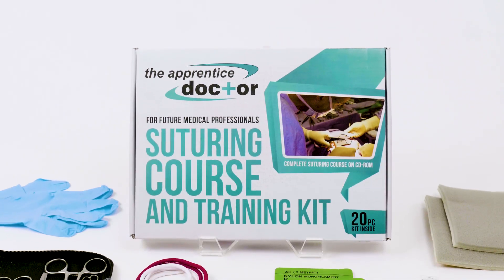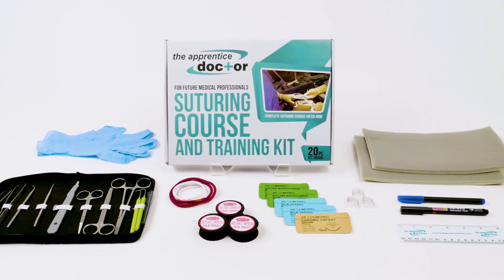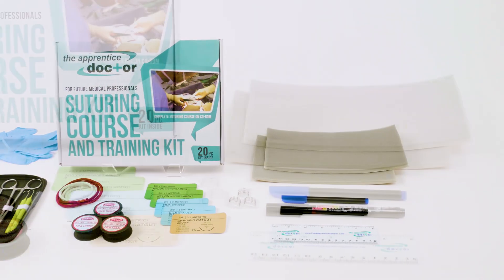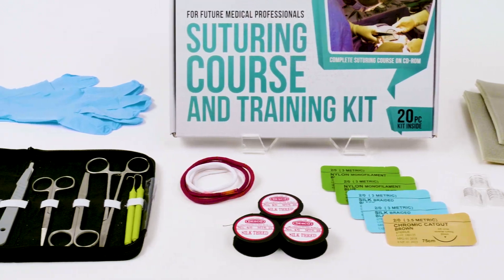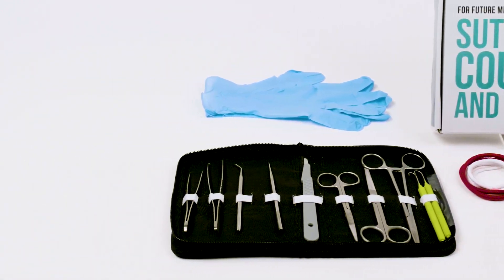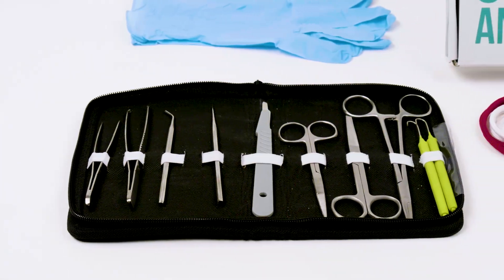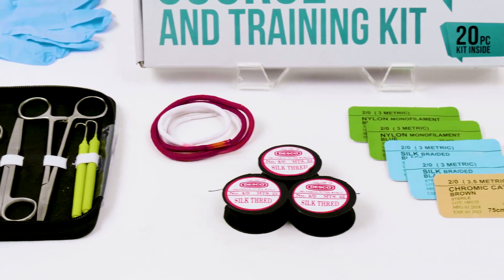The Apprentice Doctor's popular suture kit has everything you need to practice and perfect your suturing skills. You'll learn how to perform many essential and advanced suturing techniques, how to tie surgical knots with and without using instruments, as well as how to deal with many different kinds of suturing complications — and all this from a surgeon with over 25 years of experience.